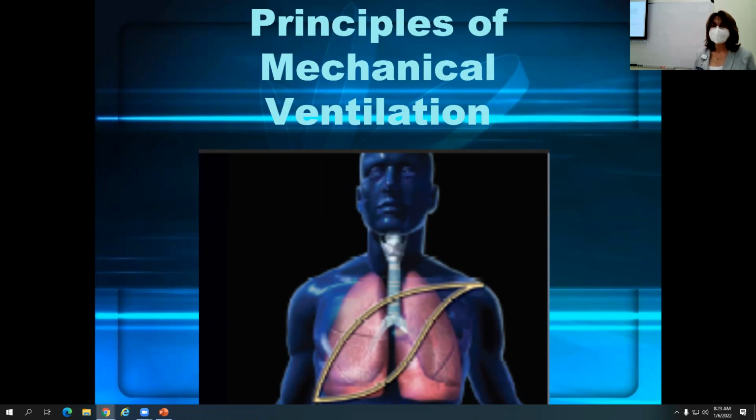All right, and then to write down some notes, and I can also put it in the chat so you can copy it down. Who needs a ventilator? Like, why does a patient end up having to be placed on a ventilator? And the answer to that is infants through adults that have respiratory failure.